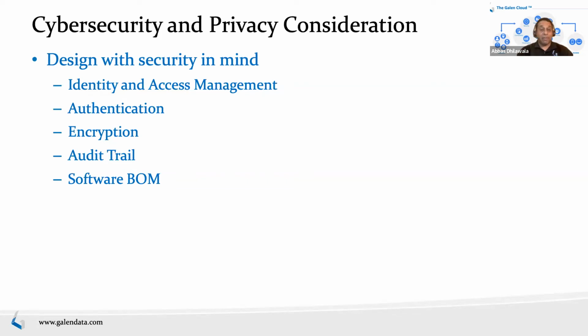Another thing is that the draft guidance is basically requesting that in the future, all 510(k)s and PMAs will need to submit a bill of materials for your software. Just like we have a hardware bill of materials, we need a software bill of materials, but importantly, we want to monitor its components for their own cybersecurity threats. For example, if you're using a logging library and that library now has some vulnerabilities, you want to be able to track that vulnerability and ensure it is not exposed to your device.